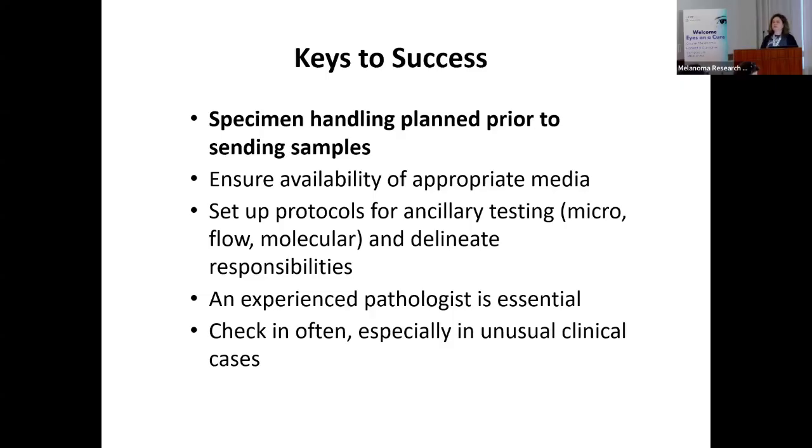So what are the keys to success? How do you know your sample is going to be handled in a way that's going to make the most appropriate diagnosis for your care? It's very important that we plan what we're going to do before we receive our first specimen. So we don't want your sample to be the first one we've ever received without even knowing it was coming, right?